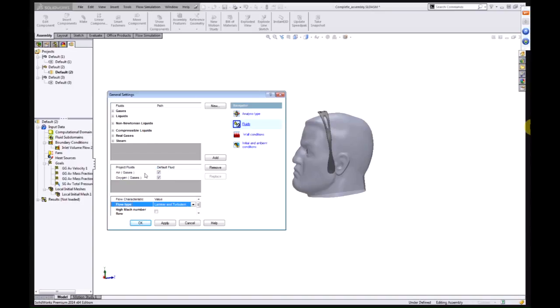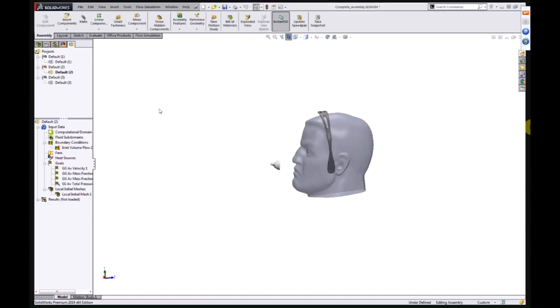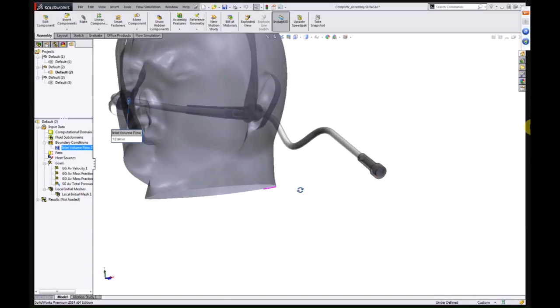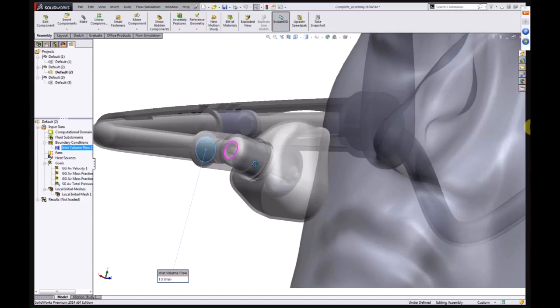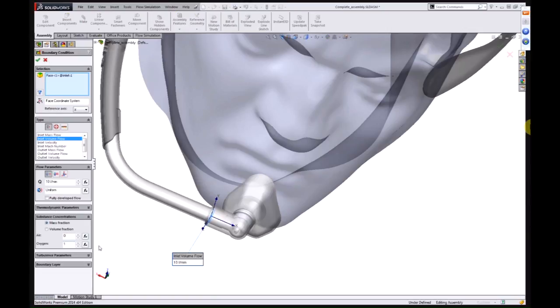We have a flow source at the delivery point to the little oxy-arm here, where we're providing 10 liters a minute of flow, and we are providing that as 100% oxygen, pure oxygen. Now, you don't necessarily want to deliver 100% oxygen to the patient for long-term care, so we're hoping we get some mixing and some diffusion as it comes out of here before it reaches the patient. And so we go off and run that analysis. That's essentially the setup. We've got a computational domain that's filled with air, and we're inserting oxygen.